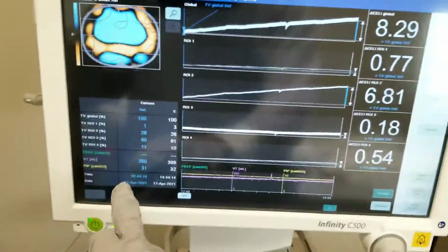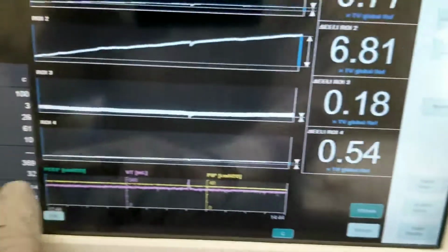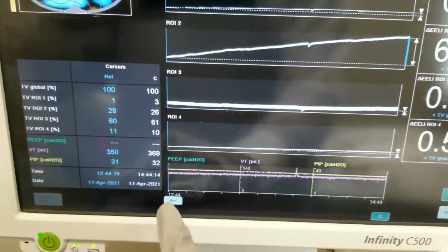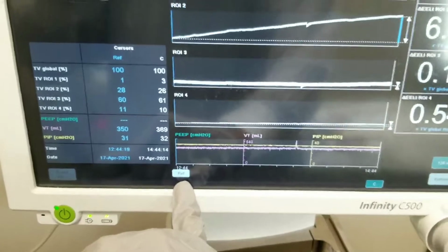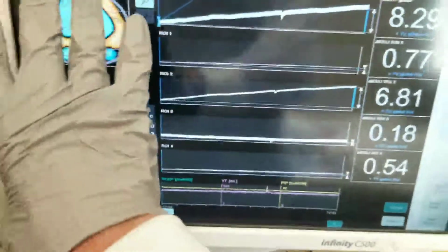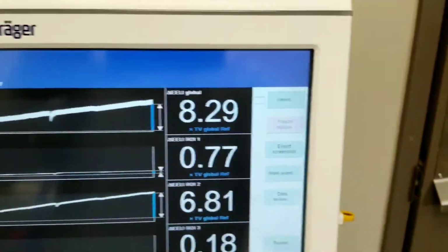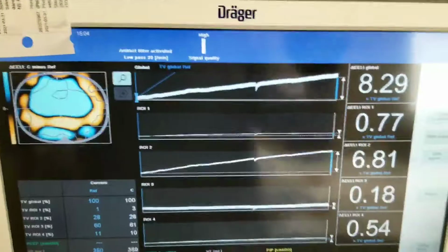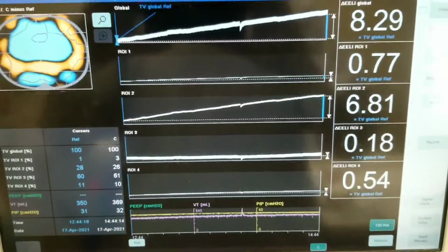screens, because I have right here you can go for 120 minutes to trend it. So this only captures at 1244, but he was intubated at 11:35. So there's a whole hour of this kind of information that is no longer accessible. But as it was happening, I was exporting screenshots. So I'm going to print those out, and I'll be able to add a little bit to this video.